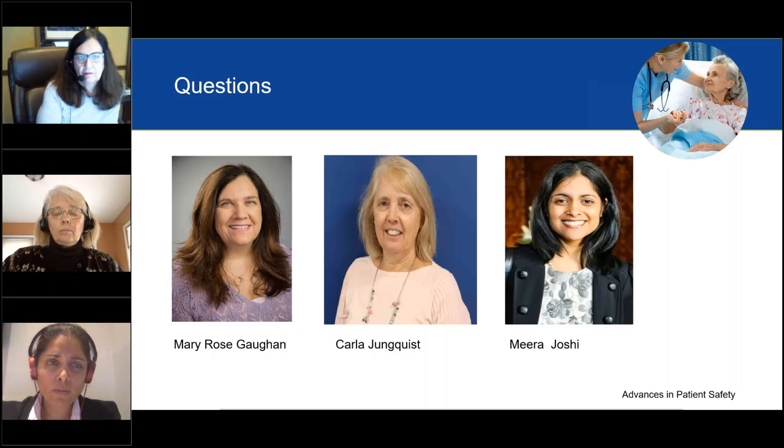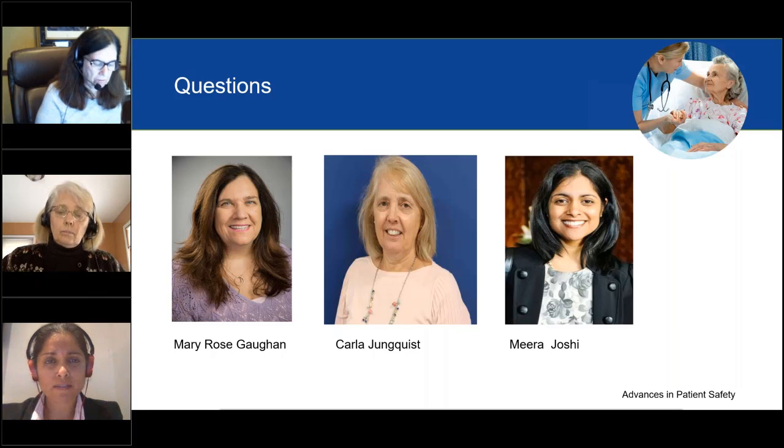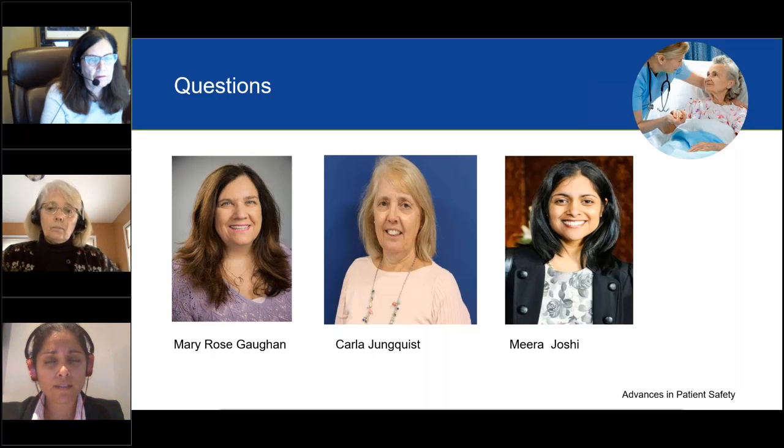In the second phase of our work, we've now done a study with another 160 patients, and in this, all of the caregivers were given a smartphone device. So they were getting real-time alerts, because much of the work that we were doing previously was to develop the algorithms that could be used. It's not just the technology itself, it's providing meaningful packets of data to the nurses and not bombarding them every time the sensor went off. We were looking at a range of data values, and only if those thresholds were hit would that trigger an alert to the nursing team.